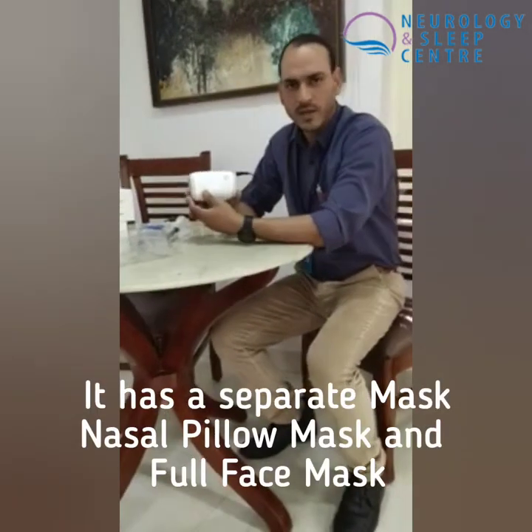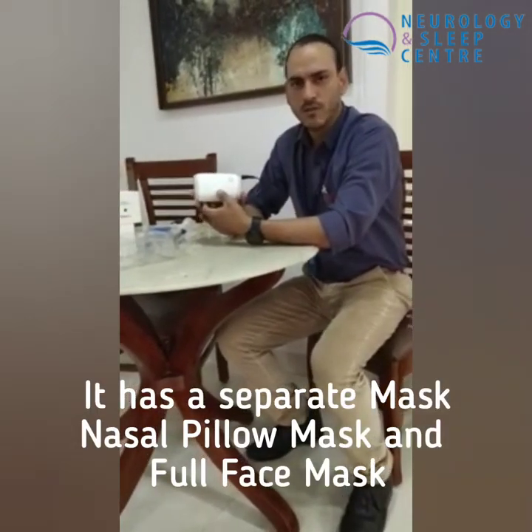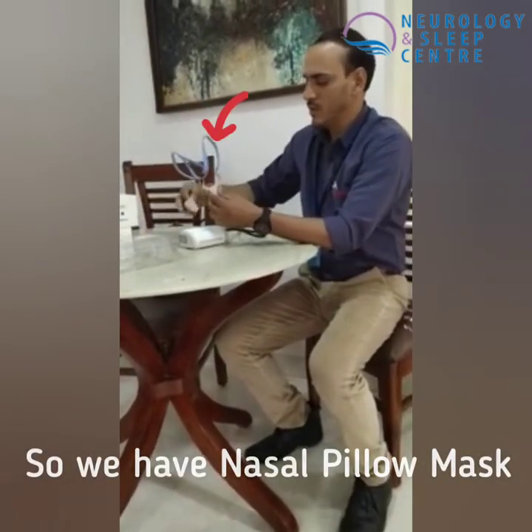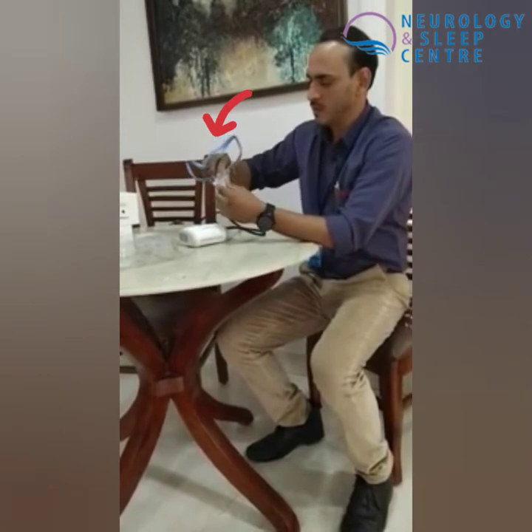This device comes with different mask options — it has a nasal pillow, nasal mask, and so on. I have a nasal pillow mask here, which connects via the tube.